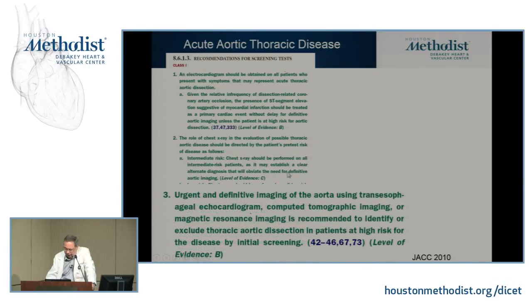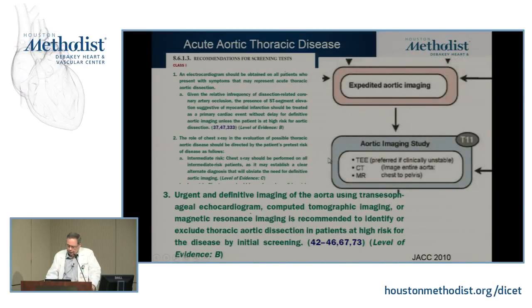Basically, this is again from the document of the guidelines, urging a definitive imaging of the aorta using any one of these imaging techniques is recommended to identify the acute pathology. Now, in that document, they talk about, and I'm going to show you the full chart that goes with this, but they basically suggest that if the patient is unstable, that TE is preferred. I would say that's probably true. However, FAISAL made a very good point. If you're in a facility that you can rush that patient to a CT and get a very good gated CT quickly, it's almost kind of a tie between those two.